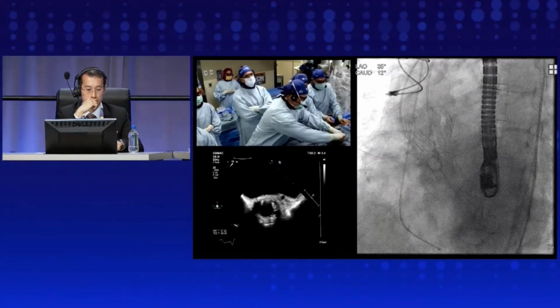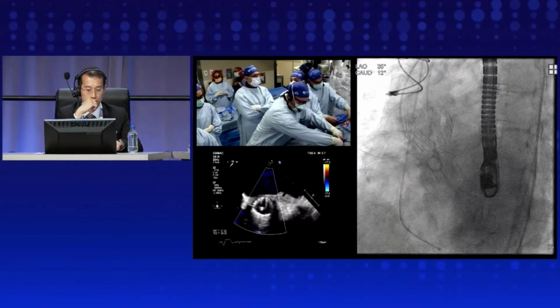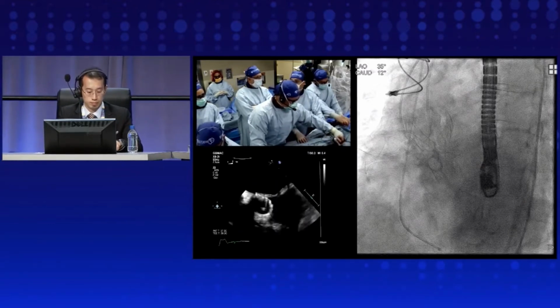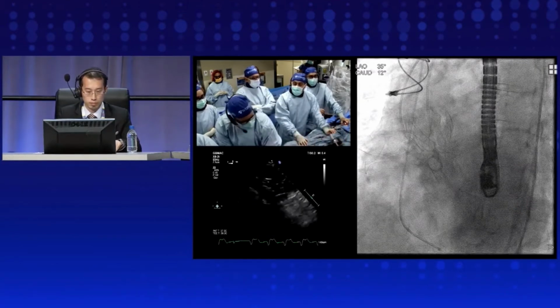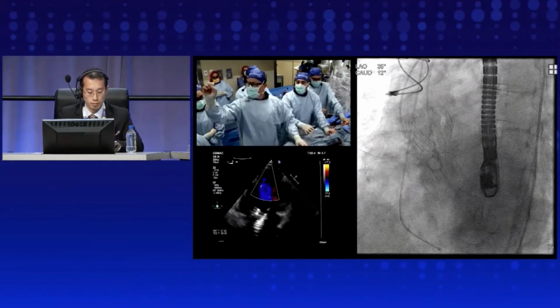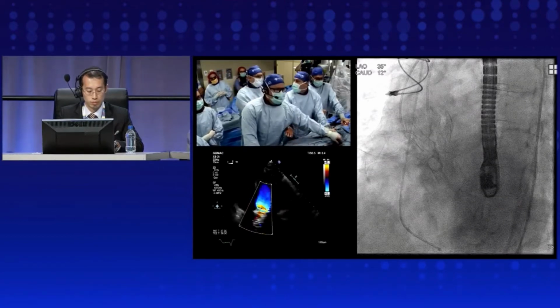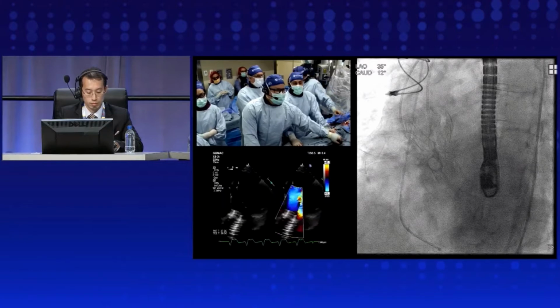So there are several steps that should be taught, and maybe this is an important time to say that this procedure should not be attempted by people without guidance or without proctorship. Still, coronary obstruction, high-risk cases could be associated with mortality, and there are issues related to that procedure that should be taught, and it's more than just seeing our live case. And please reach out to all the team that we described that was involved and know how to do the procedure, and we can guide you through it.